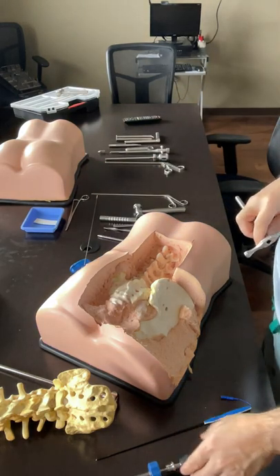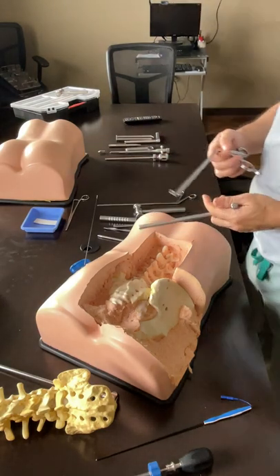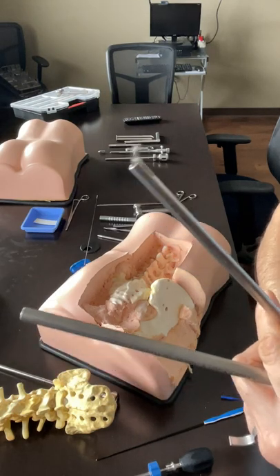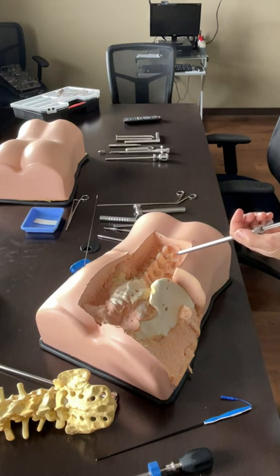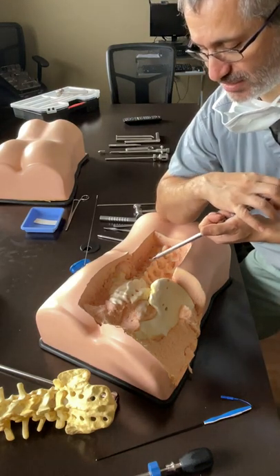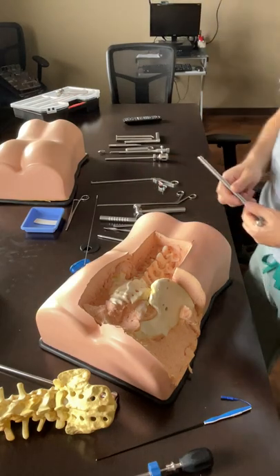Now you have loosened it significantly - you go back with the pituitary and take more pieces out. I also love the articulating rake, which we call the rotating curette. I go into both directions where the end plate is, and do this motion. Sometimes I rest my hand on the patient and do this action both forward and backward, loosen this, and then again go with the pituitary to take the pieces out.